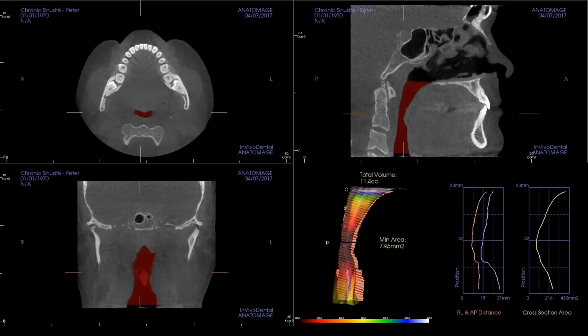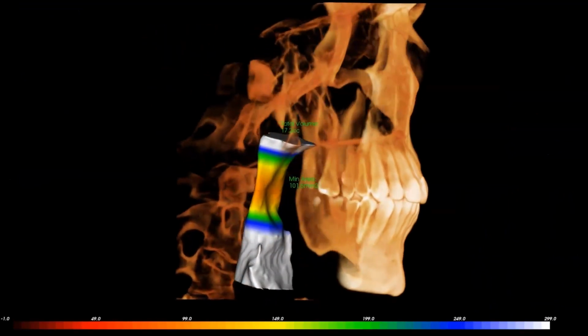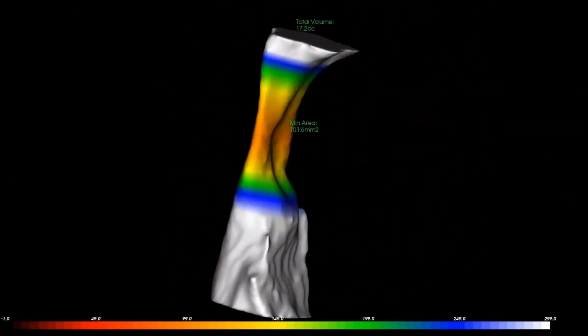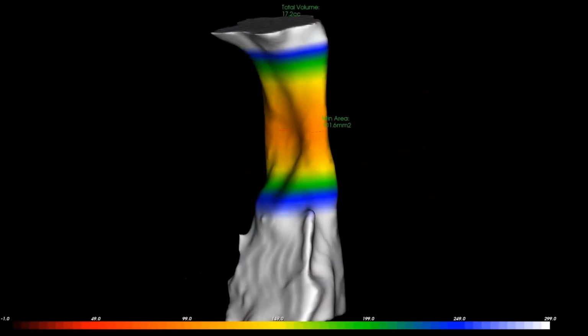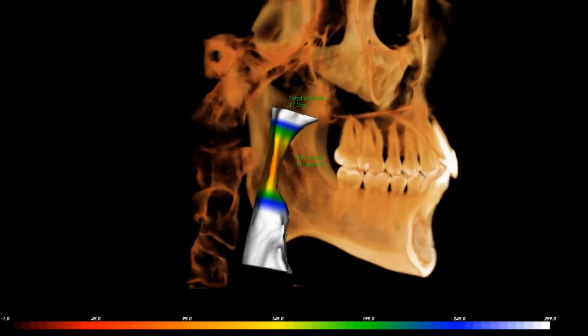And this also, again, is just a great image to show patients and elucidate that their airway is compressed because the tongue's fallen into the airway space, and educate them on that. Cool video from the software just showing this again, that indentation going back is the tongue pushing into it. Soft palate gets pushed up a little bit at the top part, but that back and that base and that deep indentation is the back and the base of the tongue. So again, the tongue is the troublemaker here. That's one of my big points I'm always trying to make.